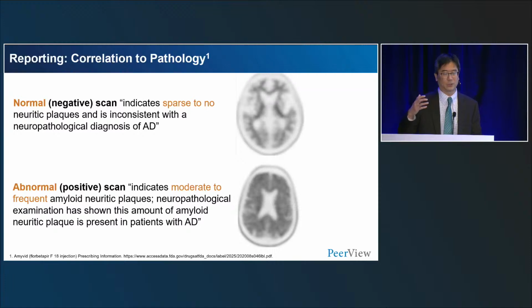And right there it reflects what we're doing. We're actually being like molecular pathologists, right? Instead of a silver stain, we're using a radioactive stain. We don't say that this is consistent with Alzheimer's disease, right? Because you can have amyloid pathology and it not be the reason why you have any symptoms, okay?